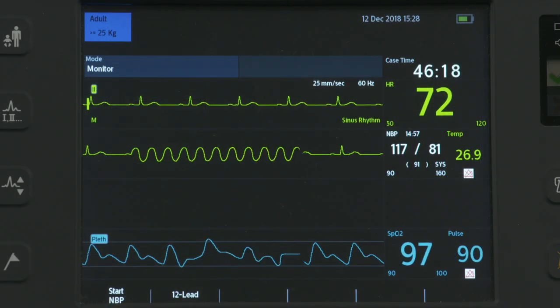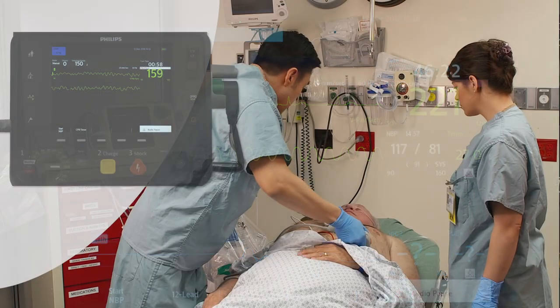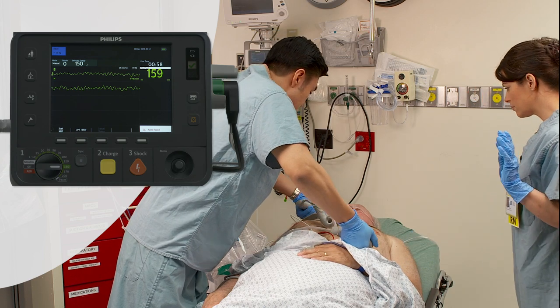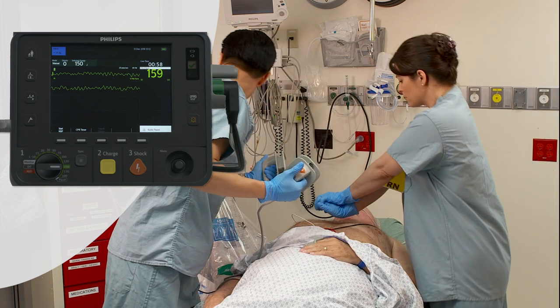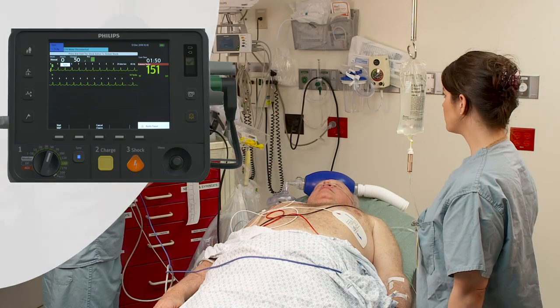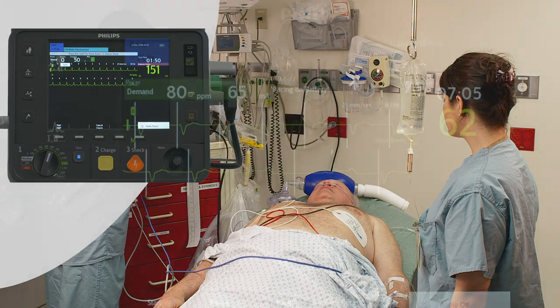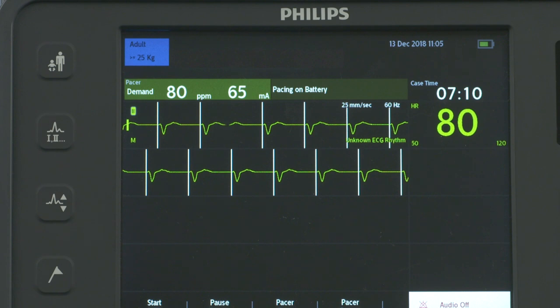While monitoring, alarms alert you to changes in the patient's condition. Manual Defib Mode offers easy 1-2-3 defibrillation using multifunction electrode pads or external or internal paddles. Manual Mode also allows you to perform synchronized cardioversion. The optional pacing mode offers non-invasive transcutaneous pacing therapy.